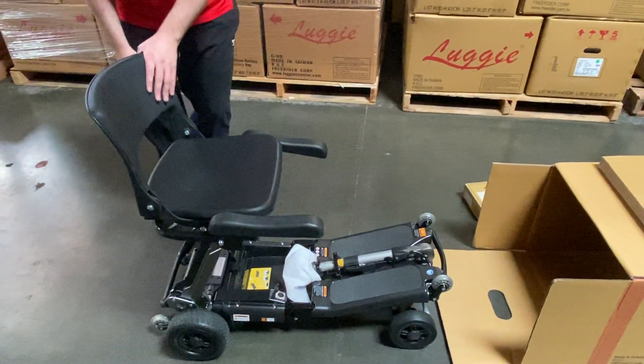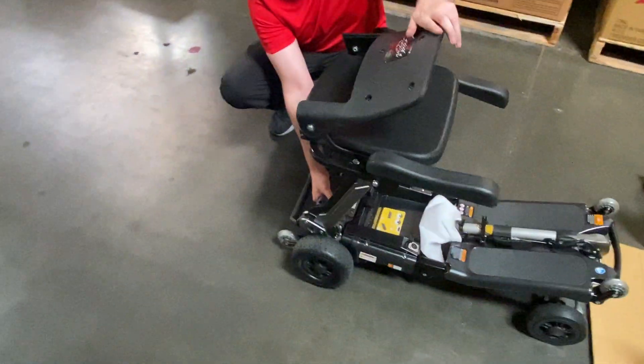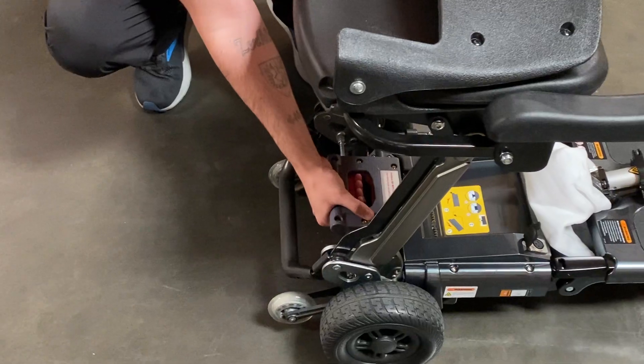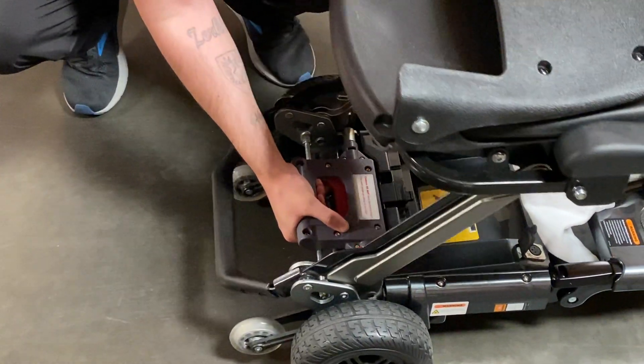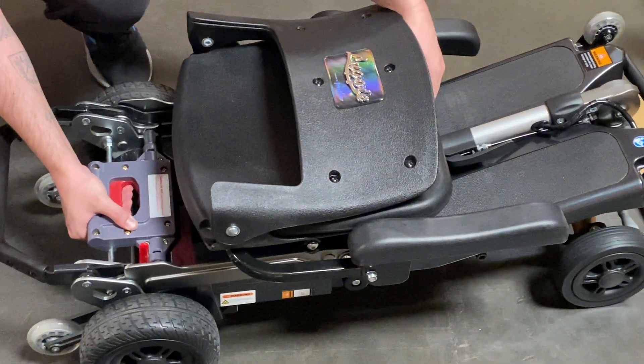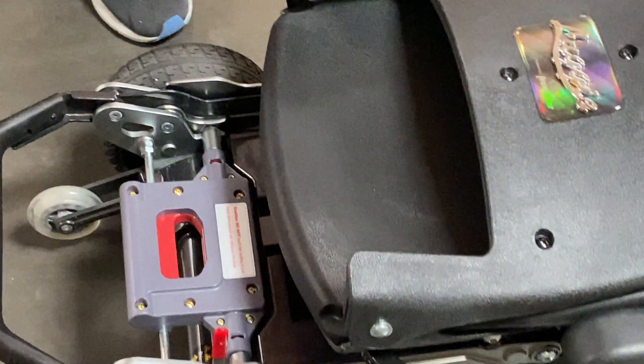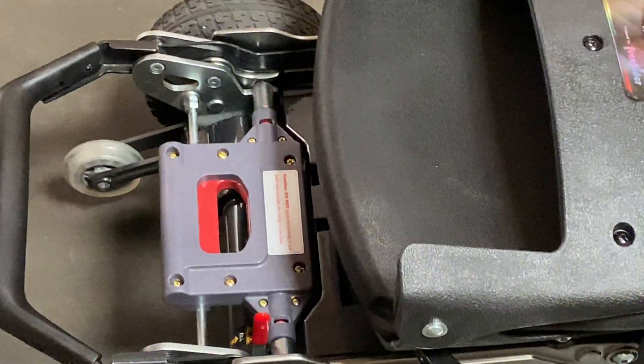Come back over to here. Push your seat back all the way down. Pull on your seat lock release. Make sure you have two red lines on either side of your seat lock release handle.